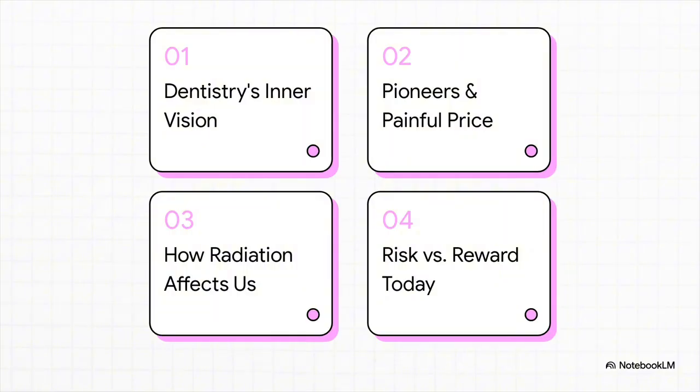First, we'll explore why dentists even need these X-ray superpowers. Then, we'll meet the pioneers who figured this all out, often at a terrible, terrible personal cost. After that, we'll break down the nitty-gritty science of how radiation actually affects our bodies. And finally, we'll weigh the risk versus the reward right here in the 21st century dental office.